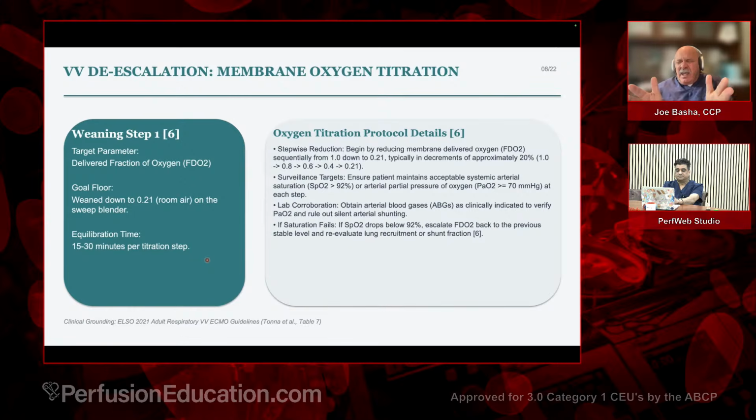I wouldn't continue. And I would say, hey, let's get a gas. Let's confirm all of these numbers. Let's see anything else that might be happening, because we don't know what the CO2 is doing right now, and so forth. And is this number even real? So, you do a gas to confirm all of that. And it may be you just have to sit there for several hours to a day. Because if you go from 80 to 70, and your SpO2 falls from 98% to 94%, trying to go down any more than that, I just think it's going to fail. So you can't be always in a hurry as far as that's concerned.